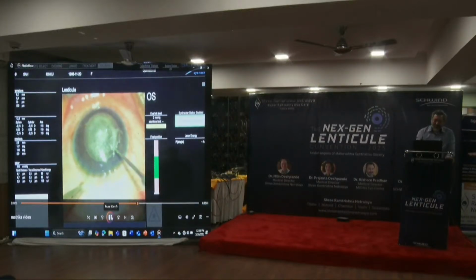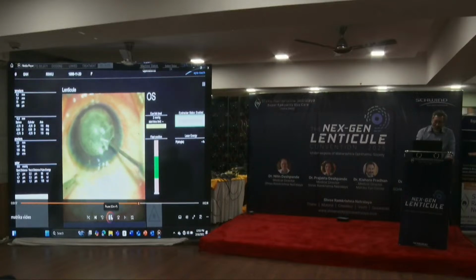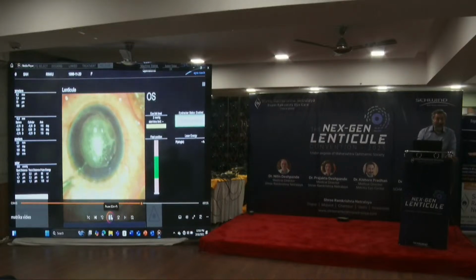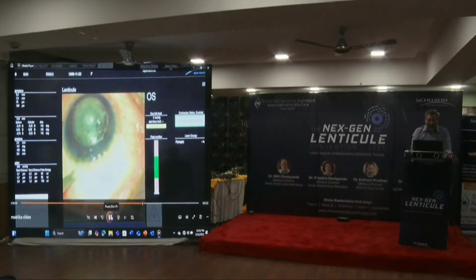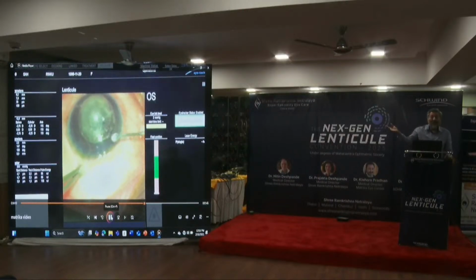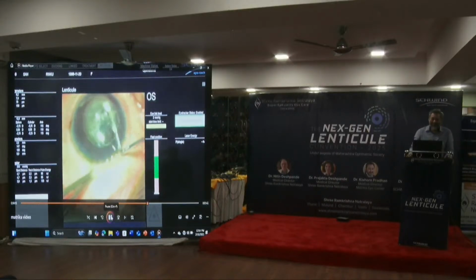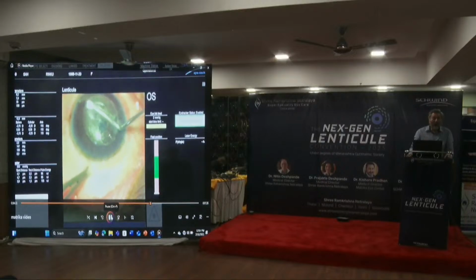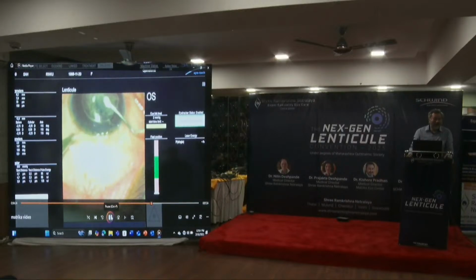And then you feel the resistance over the lenticule again on the other side. This is my video, so you see how different it is from the Chinese surgeon's video. As Dr. Nitin said, every rub is one day extra for your recovery. Now we know that we are over the lenticule. Means don't move your eye, you get a cut.